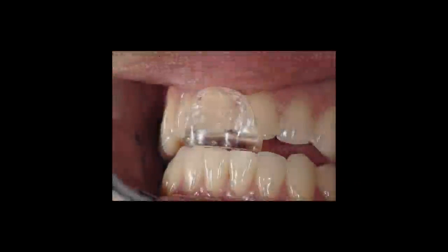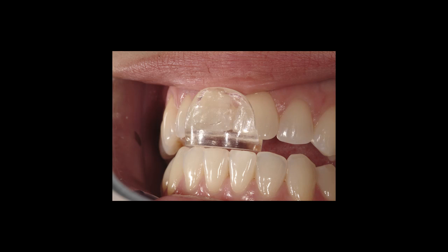When we place a Lucia jig, our goal is to have the table that they occlude on parallel to their incisal edges with smooth guidance in a right-left direction, but also have the table parallel to their occlusal plane or flat in an AP direction and not create an incline.